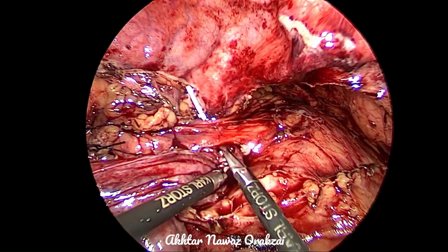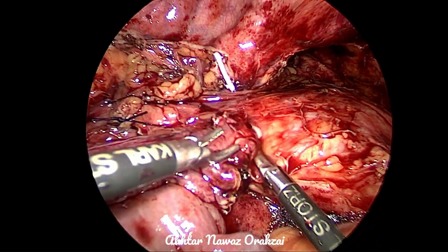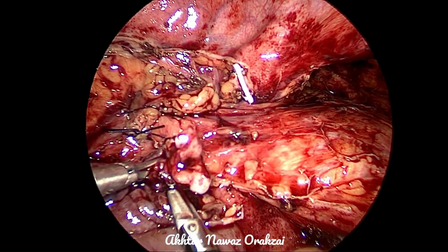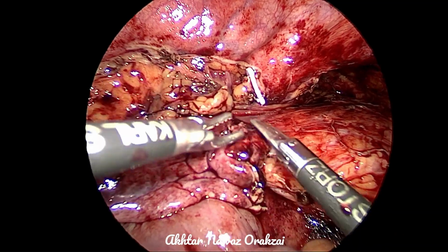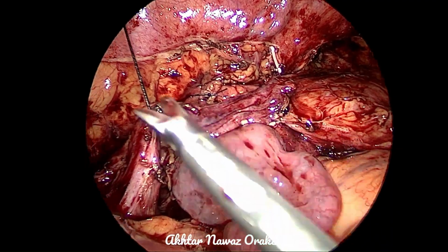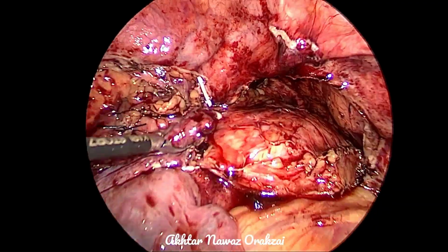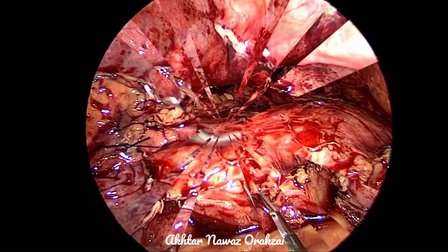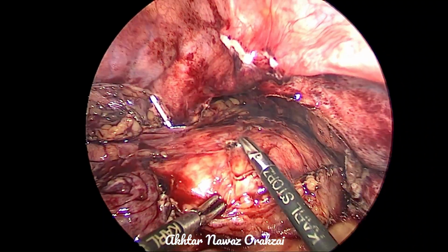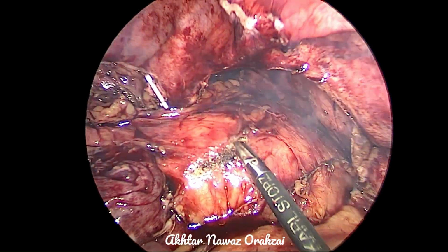So there is a sling applied. If we remove this sling from the ureter, this will make anastomosis easier without tension. The ureter is healthy, its distal end is vascular, the peritoneum is attached on the ureter. That's why it becomes a little big. However, we should not be removing this peritoneum from the ureter, as it will devascularize.